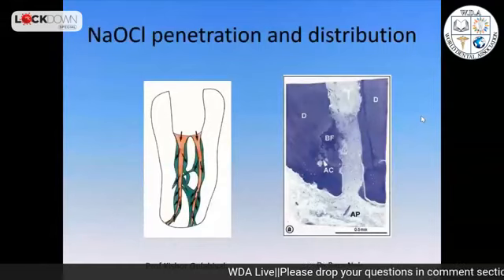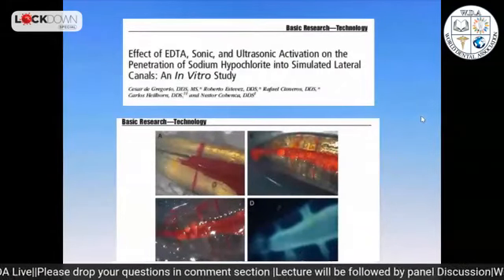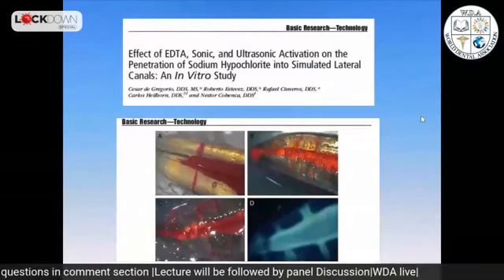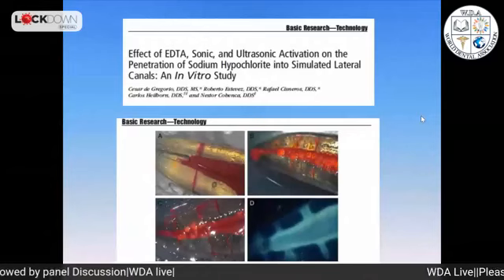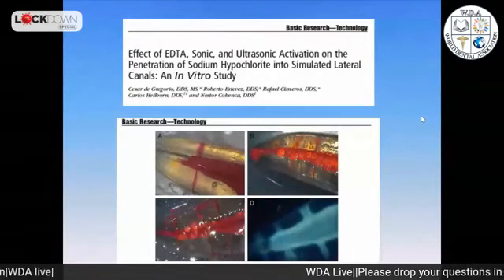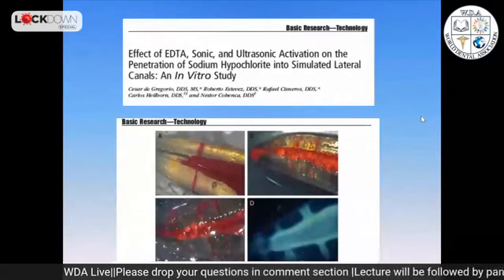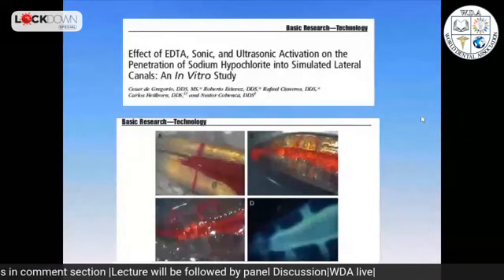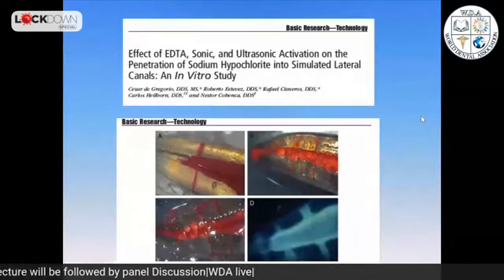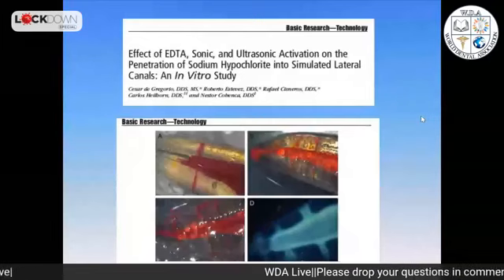at the apex. We know from millions of studies that all this sort of agitation will increase the penetration laterally and apically. This is, again, more studies from my friends in Madrid. You see how the different chemicals, made visible with red dye or radiopacified, enter a lot deeper in the spaces if you agitate them. So it's a really important concept.